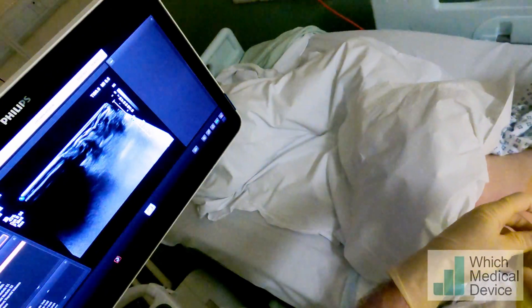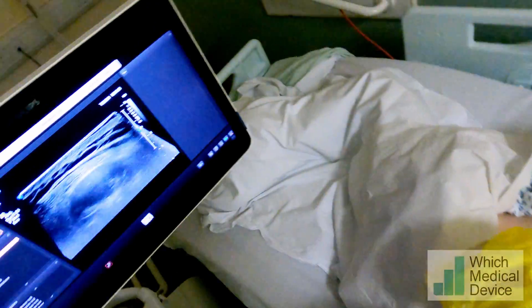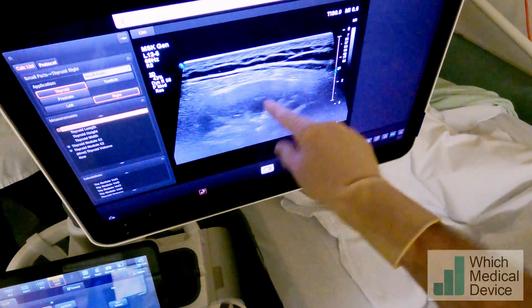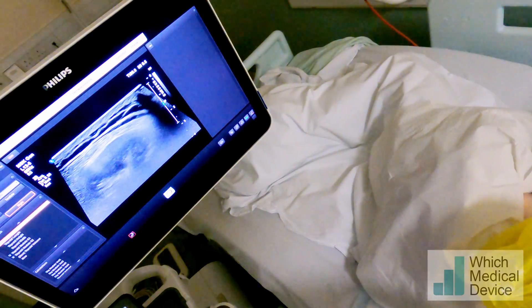Just going to have a look with the ultrasound — this is going to be cold on your back like it was before. So we've got a nice view of the abnormality here so we'll be coming in from this angle. That's my finger pressing and that's where you can see we'll be coming in there at quite a shallow angle.